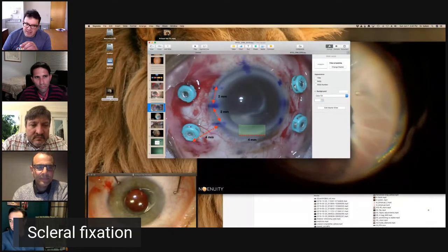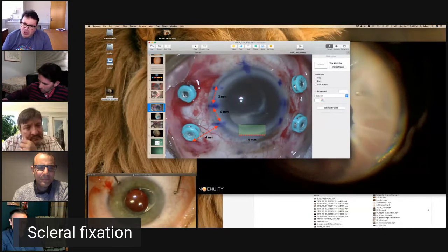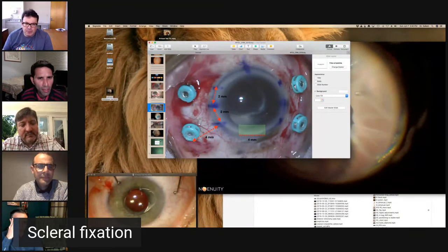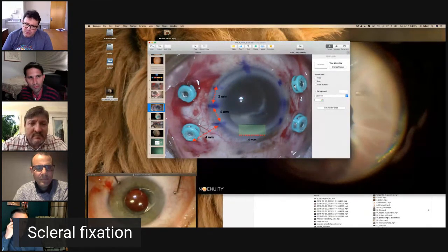The idea is that you want to just try to get the right tension. Of course, it's not science, really. It's experience, and you try to get it right. You don't want it to be so loose, and you don't want it to be tight. I find this sliding not so very useful, really. I put my sclerotomy a bit closer, in the region of 3 millimeters from the limbus. I think that's fine as well, but I feel like clearance from the iris of 3.5 to 4 millimeters is important with these lenses.